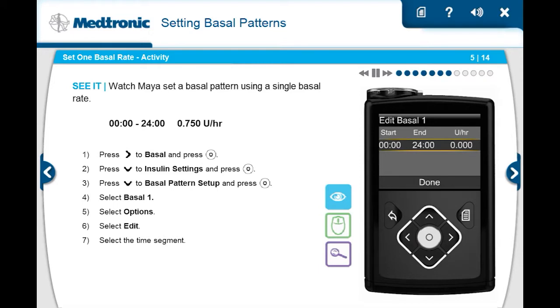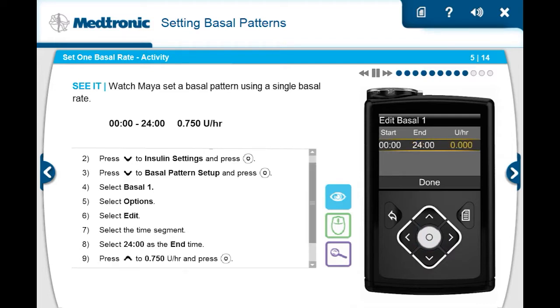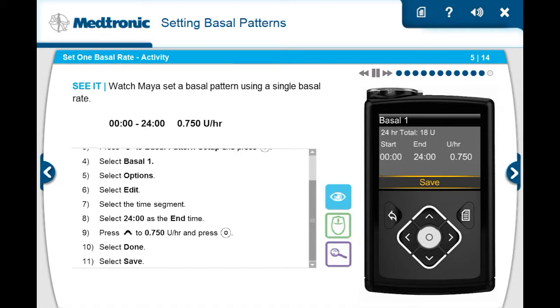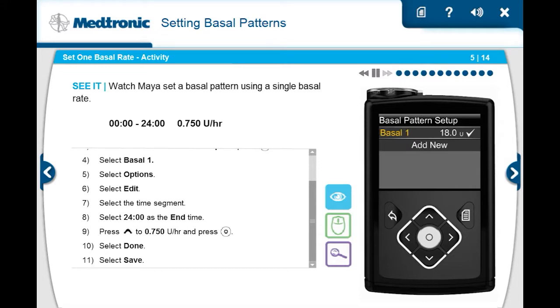She presses select on the time segment. Then she presses select again since she's only setting one basal for all 24 hours and doesn't need to change the end time. Then holds the up button to quickly scroll to 0.750 units per hour and presses select. She selects done, checks to see that her basal rate has been entered correctly, and selects save. Maya is done setting one basal rate.